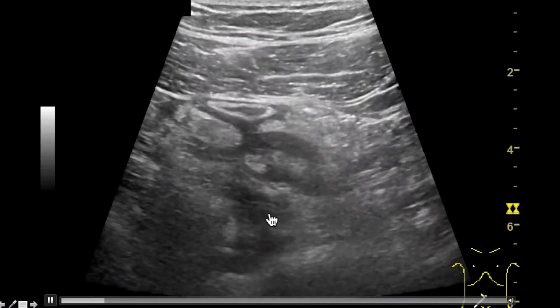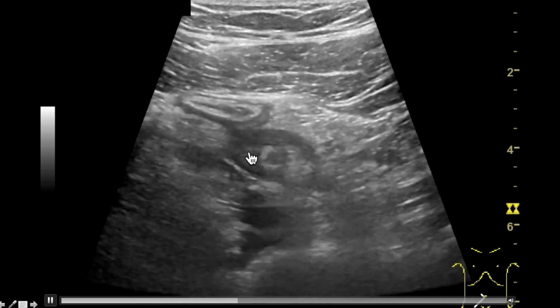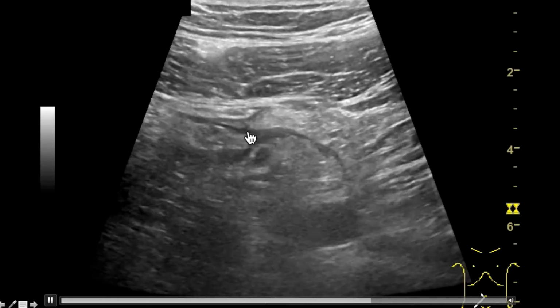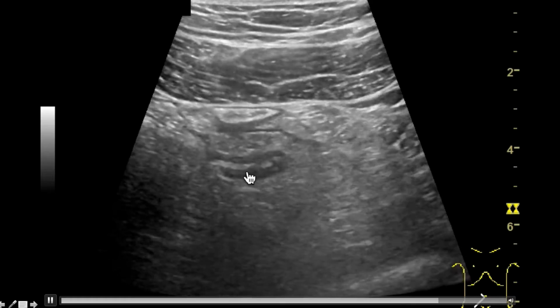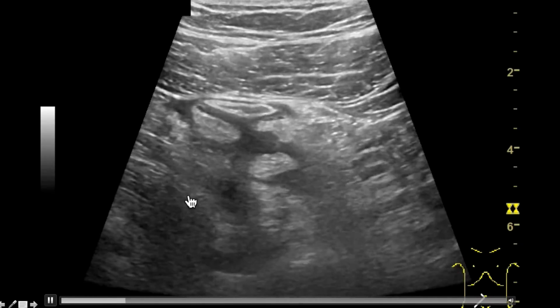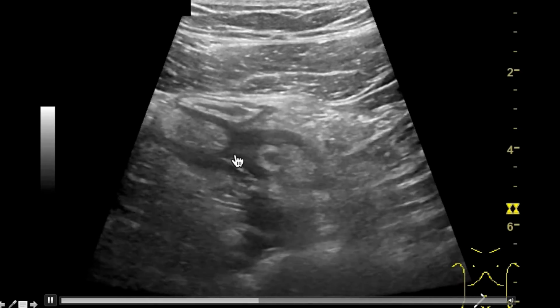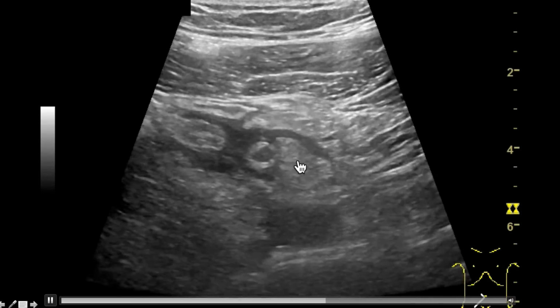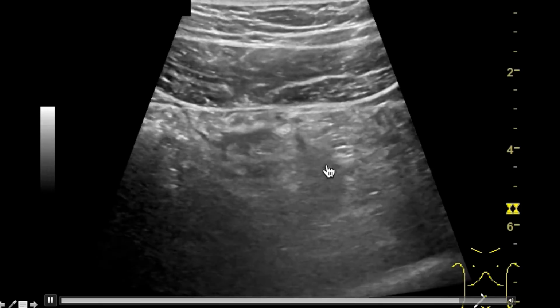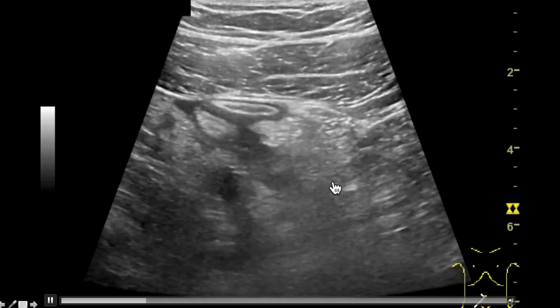Let's look at the second level here. Again, the iliac vessels and here the wall-thickened loop of bowel. Now in cross-section, the image of the cockade. Clear, isn't it? And we can follow this again over to this structure in the right lower abdomen, namely the cecum. And from here we then see this wall-thickened loop of intestine with the surrounding reticular reaction, which runs here in an arc. It runs in an arc from the cecum over the iliac vessels.